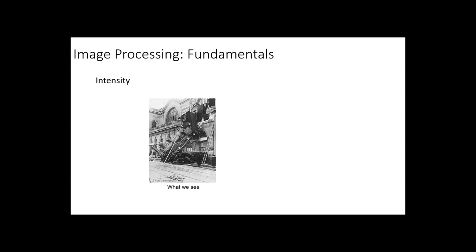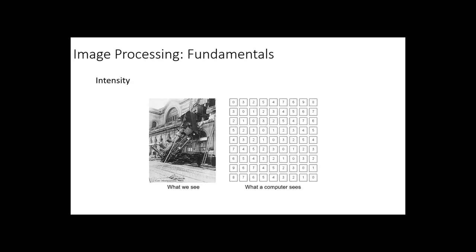Basically what we are doing is working on image intensity. This is the picture that we see; we see everything with color. So what is the data input that the computer can recognize? The computer can only recognize these numbers, pixel by pixel. So we need a set of algorithms to first recognize which point is background, and then segment the brain or part of the brain into different regions.